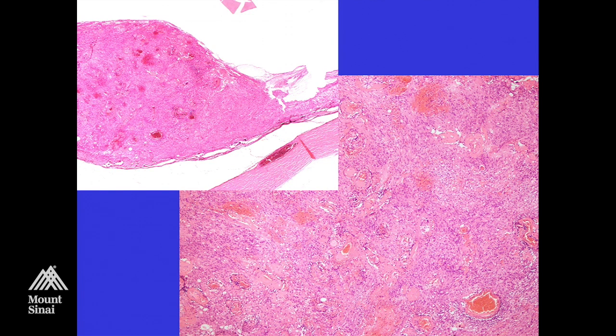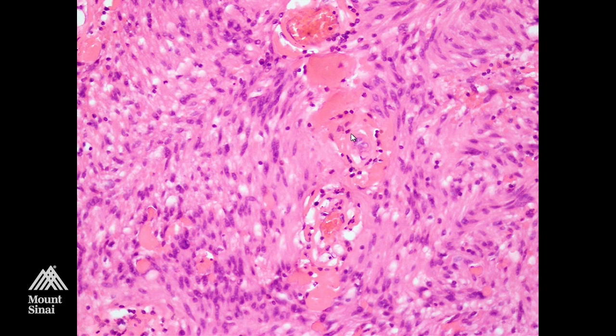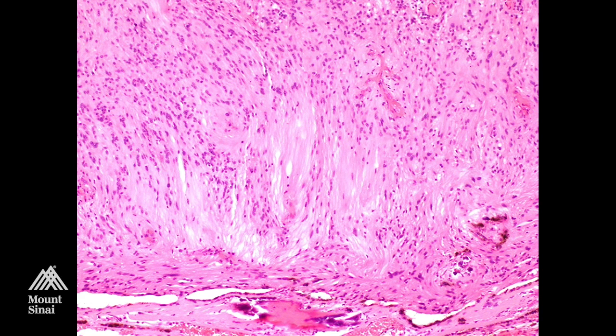Here's histologic pictures from this same tumor. Again, you can see a fairly sharp demarcation from adjacent retina. Here's the lesion. Unlike the astrocytic hamartomas of TS, again, you have all these large blood vessels in this particular case, which you can see on higher magnification here, and another high mag photo here. It looks very similar to the prior case I showed you. Occasionally, and it was true in this case, you can have these more elongated processes that in this case are not really around blood vessels but are near the underlying choroid.